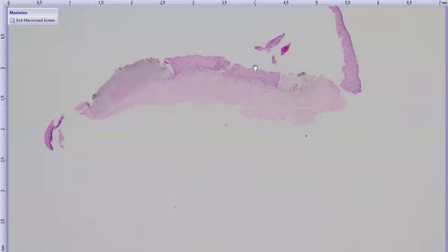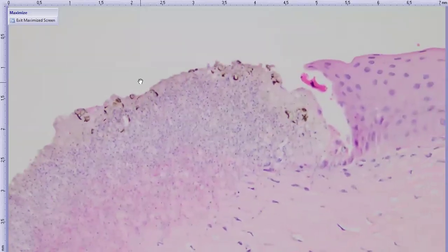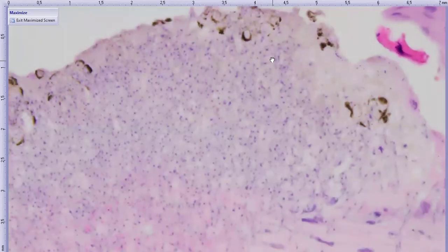All right, so here is a couple keratectomy specimens. We have superficial corneal stroma, and we have kind of thickened corneal epithelium that is abruptly disrupted and replaced by a mat of fungal hyphae and probably some conidia here. They're partially pigmented.